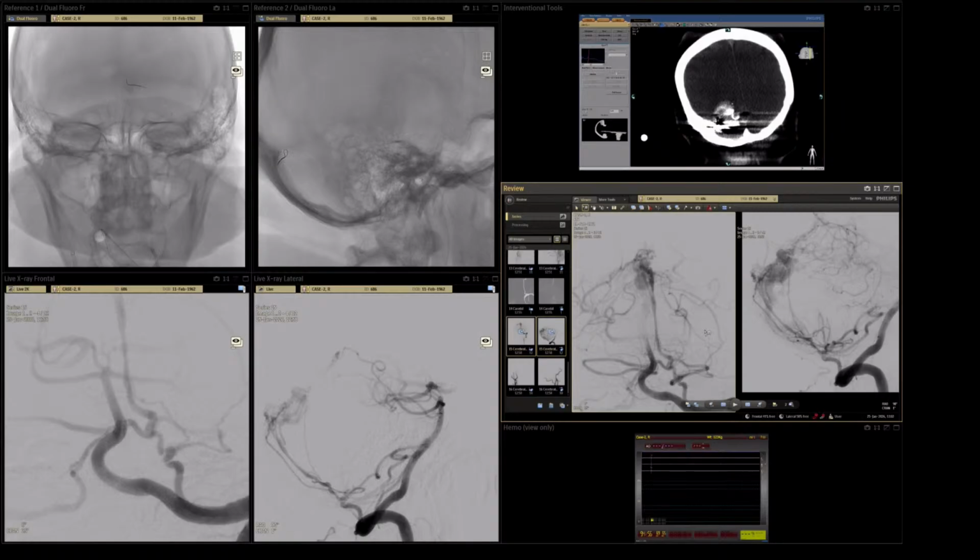Okay, our Y connector is leaking. It was a bad surprise. It was a Riva Y connector from bulk. It was leaking without pressure.